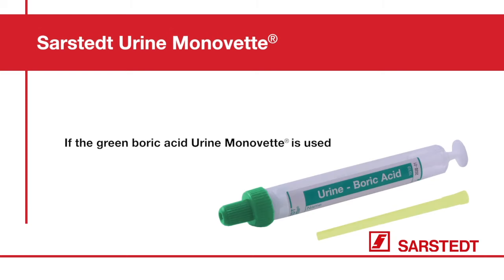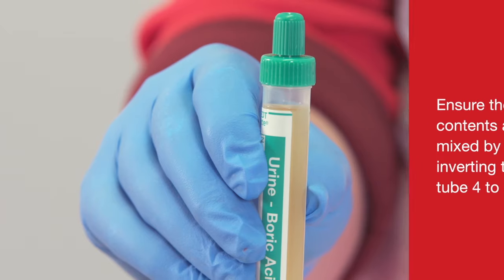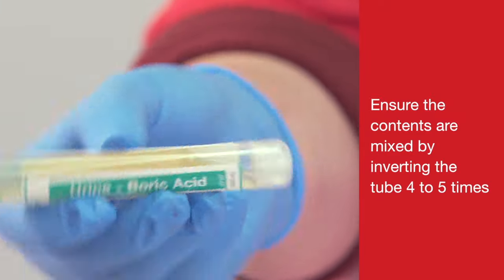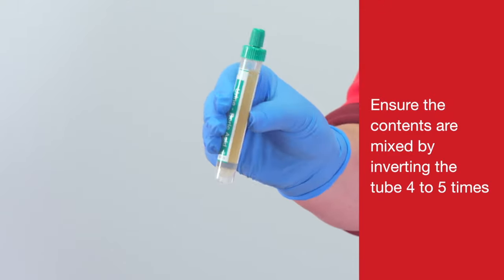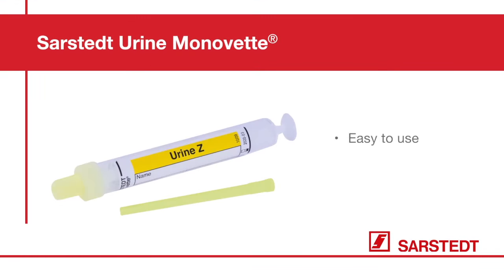If the green boric acid Urine Monovette is used, ensure the contents are mixed by inverting the tube 4 to 5 times. The Sarstedt Urine Monovette is easy to use, safe and hygienic.